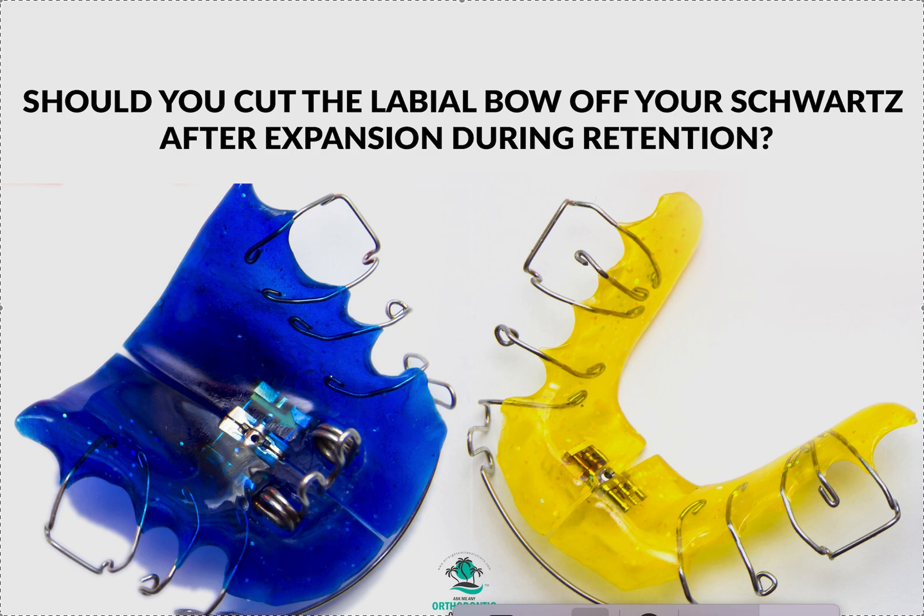Like in this situation right here, we have a little crib and labial bow. If you're done expanding and you don't need it active because you're just in the passive retention phase, or you want to throw some brackets on — keep in mind if the patient has space and the appliance is worn full-time for retention, space won't close. But if you had crowding, you could put brackets on. If you cut the labial bow off during the retention phase, it might compromise retention. So do this with care — if it compromises retention and you cut it off, you'll need to make a new one, which is an additional lab cost you cannot charge the patient for. But sure, if you need it cut off, cut it off.